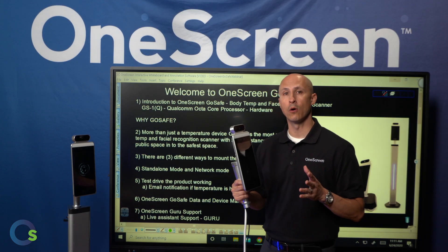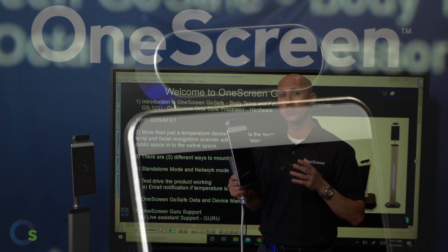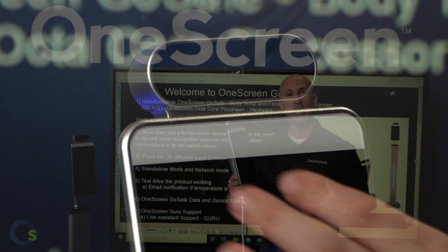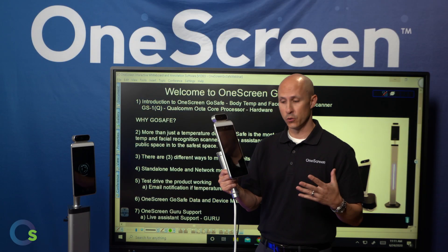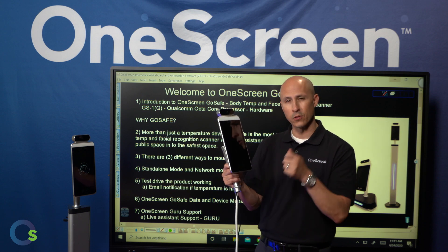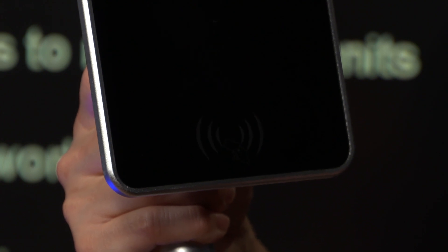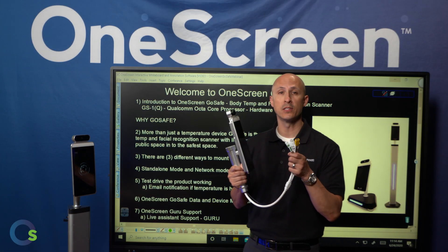Now let's take a look at the OneScreen GoSafe hardware. At the very top of the device, we have a Belgian-made thermal scanner that's scanning the temperature of your forehead. Additionally, we have built-in cameras for facial recognition, and we have an 8-inch display for visuals. At the very bottom of the device, you'll notice there's a little image of a hand holding a card, as we do have application with some IC card and Prox cards. And out of the bottom of the device, there's an abundance of cables.